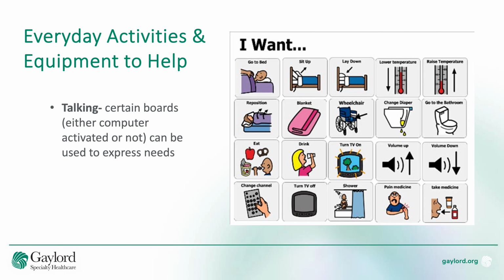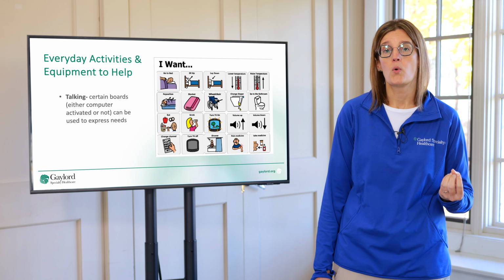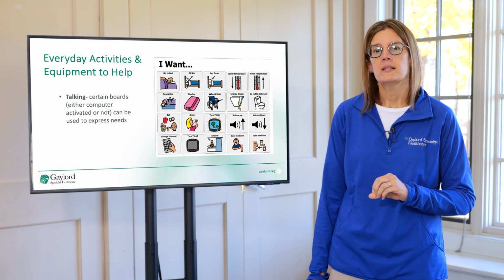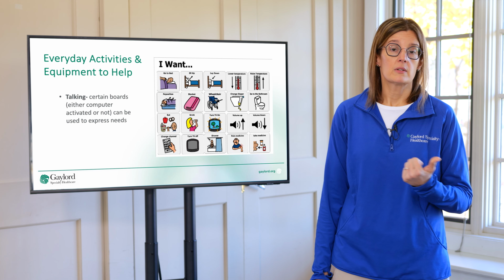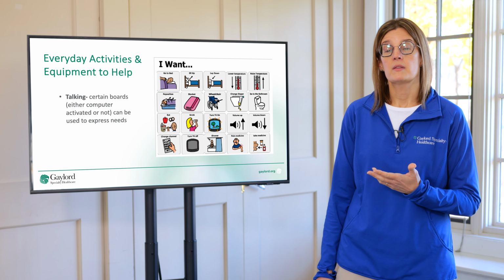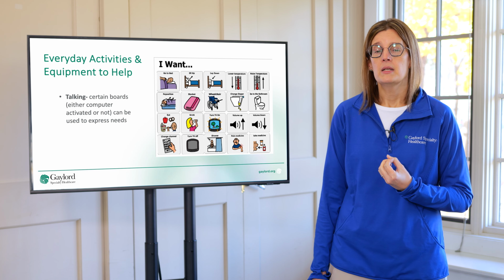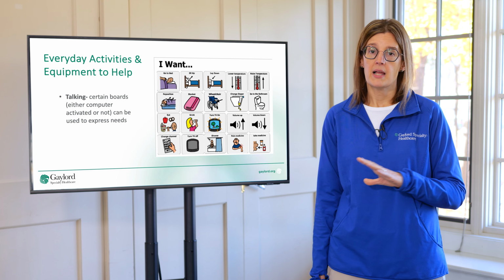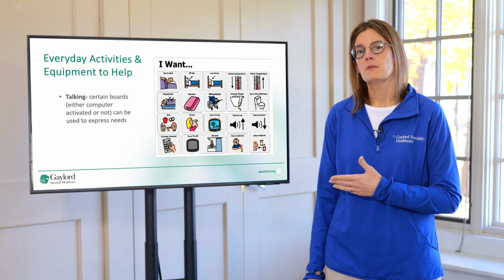This is a really important one. We spoke in another video on communication and some of the communication impairments that stroke survivors will experience. And so your speech therapist may issue for you a communication board. And that's something that might assist you with being able to communicate certainly with your loved ones, communicate basic needs with the staff, even just to get your point across. And they come in a number of different functions and complexities. Your speech therapist will introduce the tool and then help you with designing it to best meet your needs.